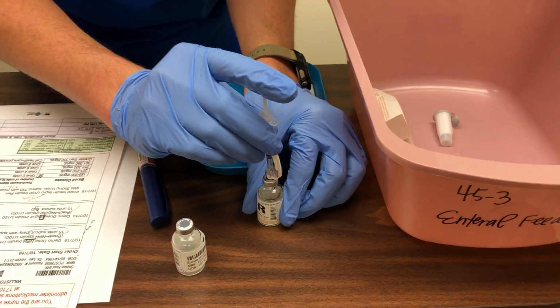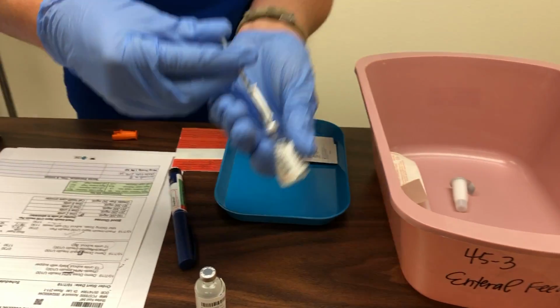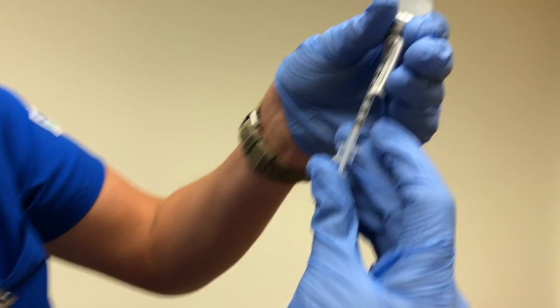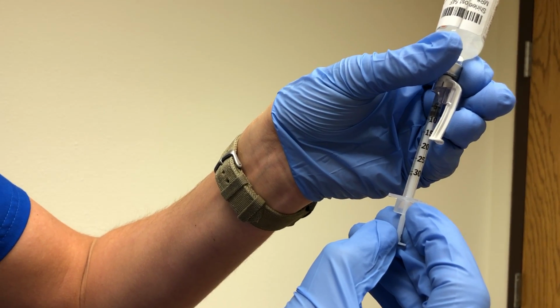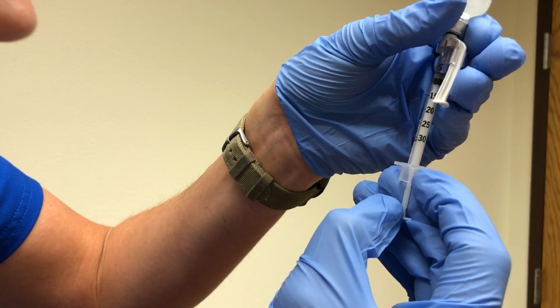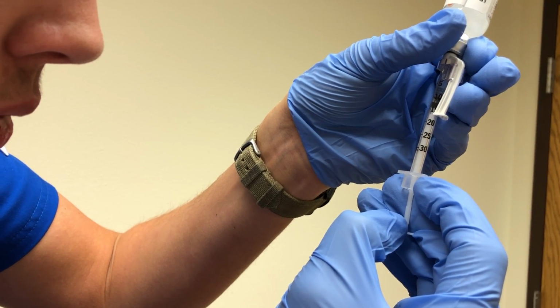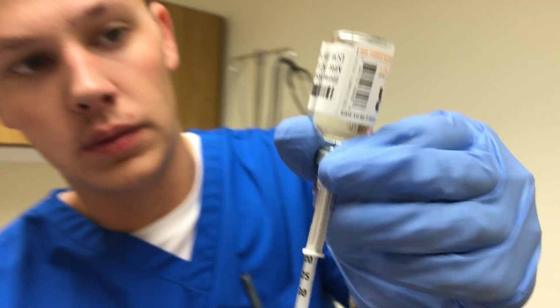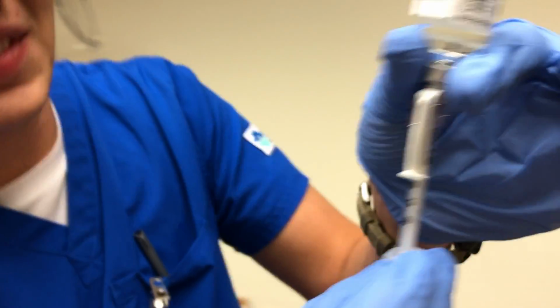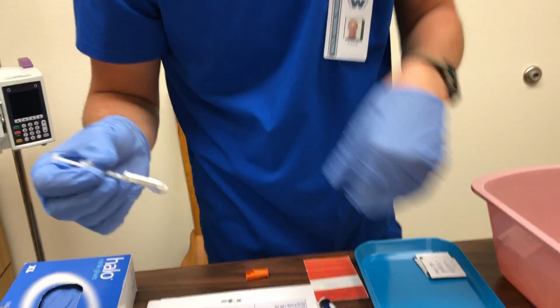I'm going to go in. So now I can invert it and pull it to 10 units. So right there, we're at 10. Okay.